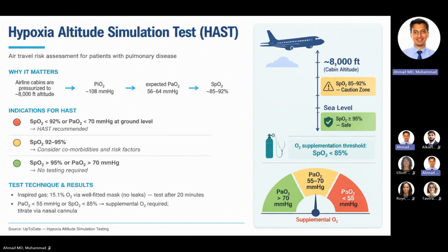We do have this in our hospital here. How this is done is they inspire gas, 15.1% oxygen, via a well-fitted mask for 20 minutes. If their saturations go less than 85%, they qualify for oxygen.